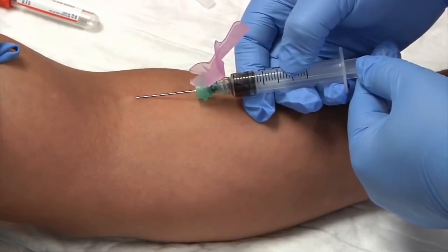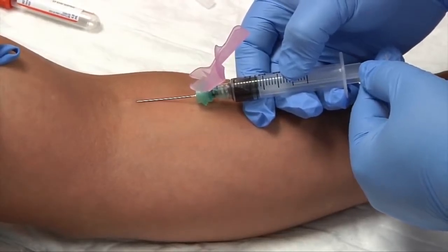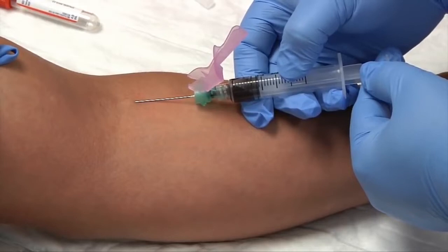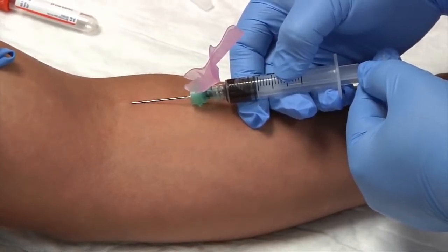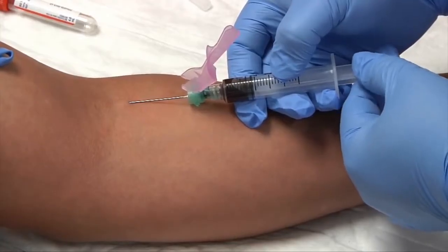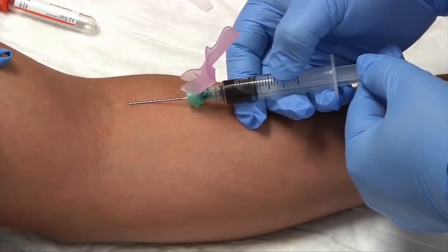This will take a little bit of time because obviously if we're doing this, our patient cannot tolerate the suction from regular tubes. It's also important to go very slow because if we pull our plunger back, we can hemolyze our specimen by pulling back the plunger too fast.